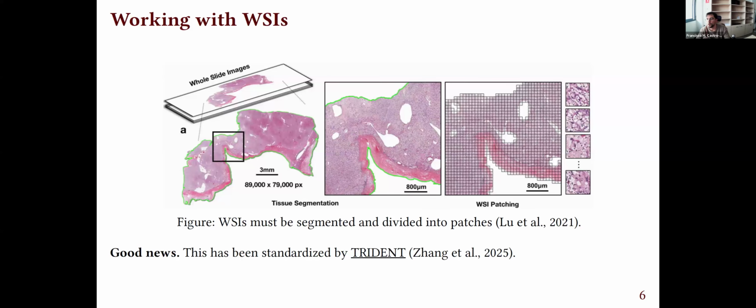Oh no, I mean, okay, I know now. I know what you mean. The good thing about this one is that the fatty tissue won't be removed by the tissue segmentation tool if the segmentation is properly done. Okay, so I think I answered that.